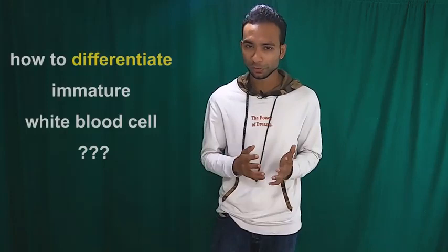Promyelocyte. When we consider promyelocyte, it is about 12 to 18 micrometer in size and usually a little larger than myeloblast cells. And actually, these promyelocyte cells are the largest immature white blood cell types. Nuclear to cytoplasm ratio is high.